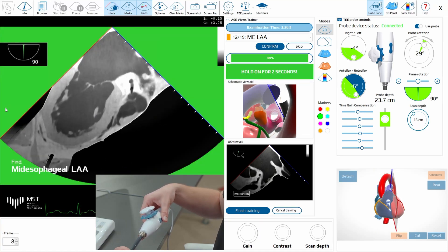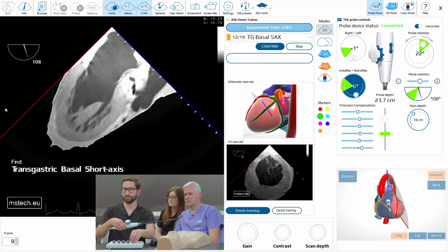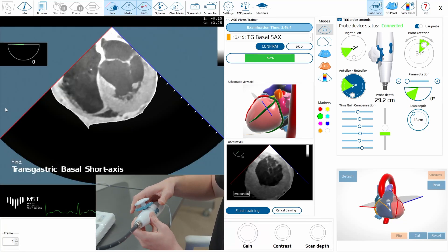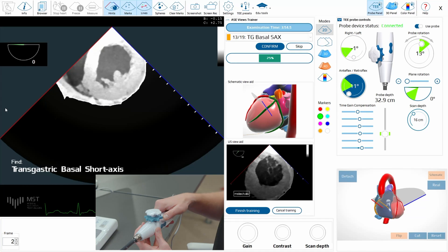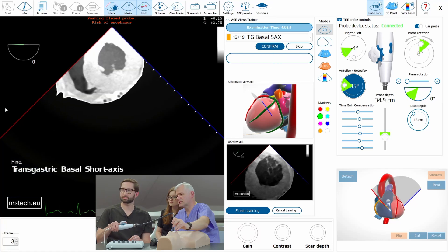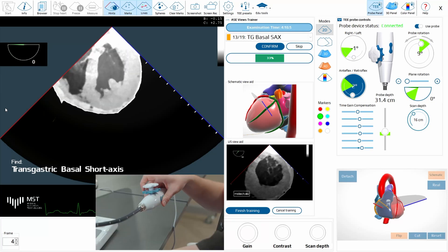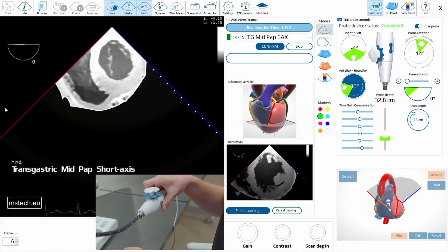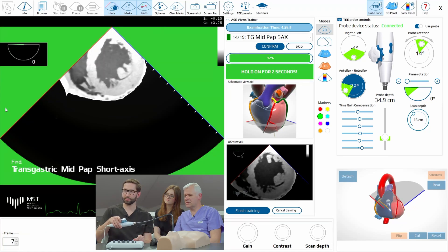Left atrial appendage now. You are too shallow. In the center, and try now to flex — do anti-flex, more anti-flex. We'll see if the report shows it. Very nice. Very good — you remembered about releasing the flex.